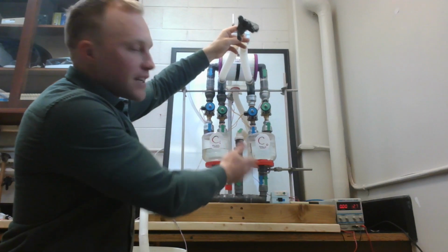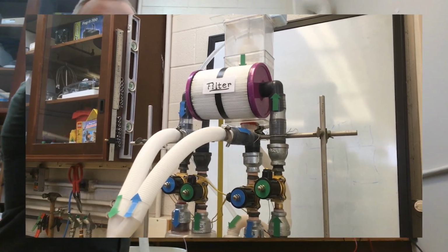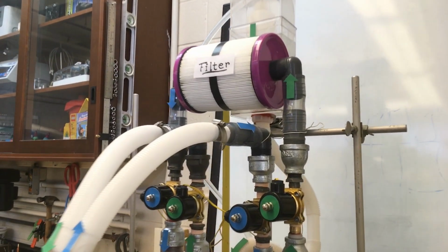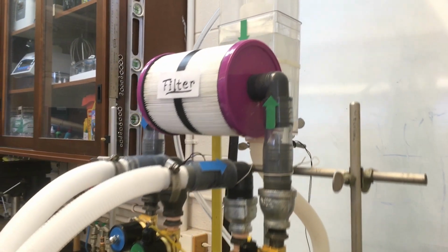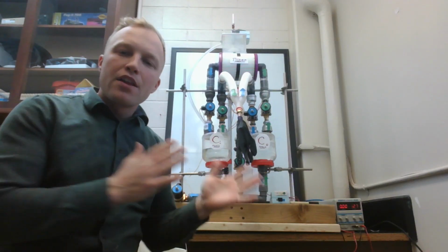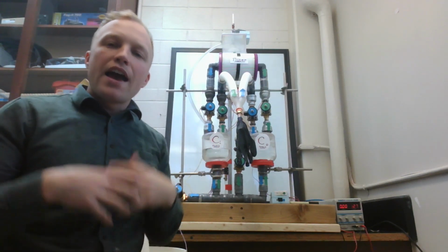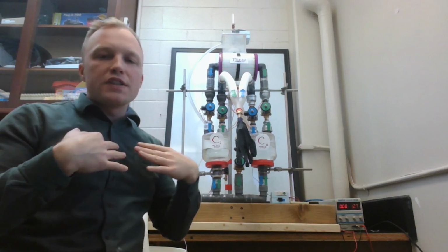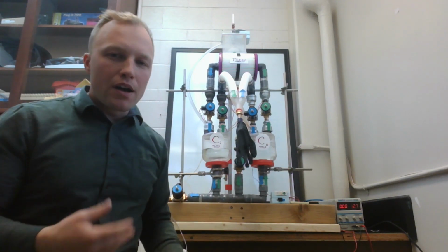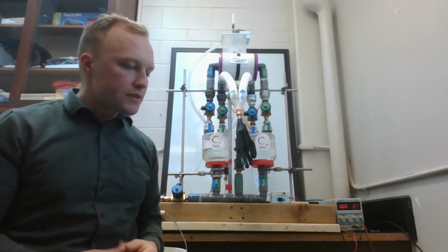On the right-hand side, when the water level rises, that green arrow is flowing air up vertically and through our filter into the room. So the exhale of a person is being taken into the right cylinder and then put into the room through a filter. The filter is also being used to filter air that comes in on the in-breath, and that way the person is protected from particles in the air in the room, and everyone in the room is protected from particles from the person, or water droplets, or virus-carrying water droplets from the exhale of the person.